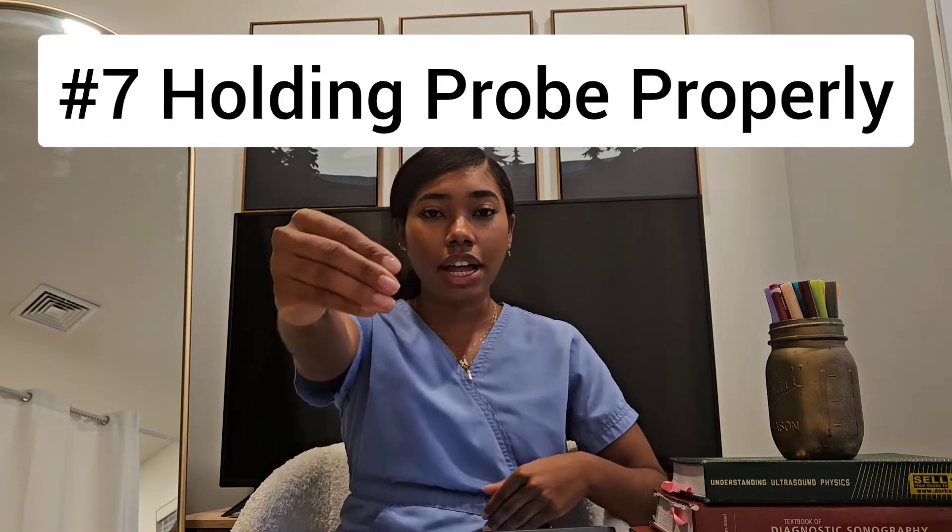When you hold the probe, do not have a pinch grip. A lot of times I hold the probe with my thumb and first finger on one side and my other fingers on the other side. When I first started learning transvaginal exams, I was nervous and holding the probe super tight without realizing it. Another sonographer came behind me and said, 'Drew, take the death grip off the probe.' Have a gentle grip. A pinch grip will hurt you long-term. Hold the probe in a way that allows maximum mobility in your wrist — you can tilt front to back and side to side.